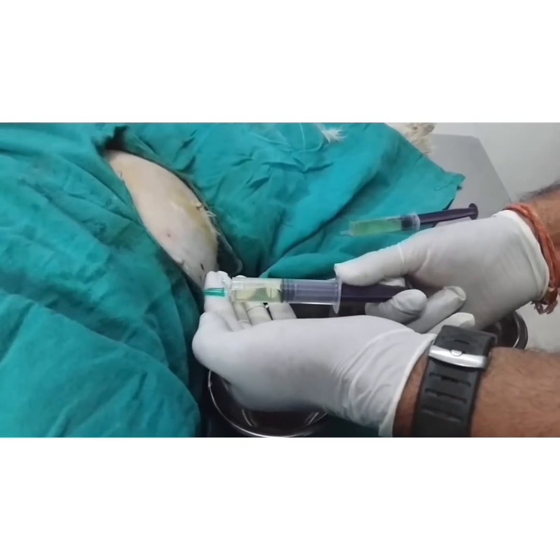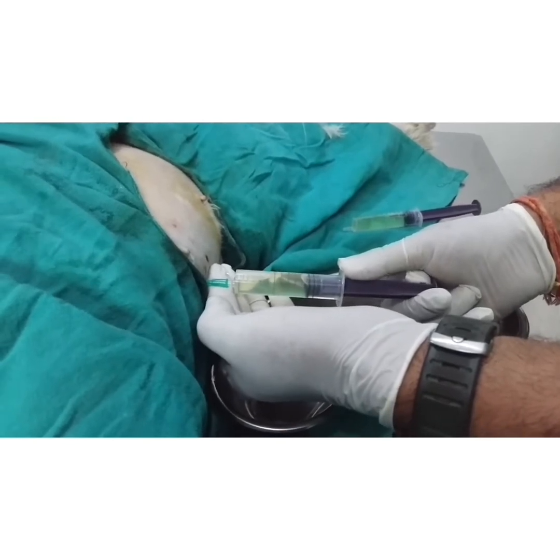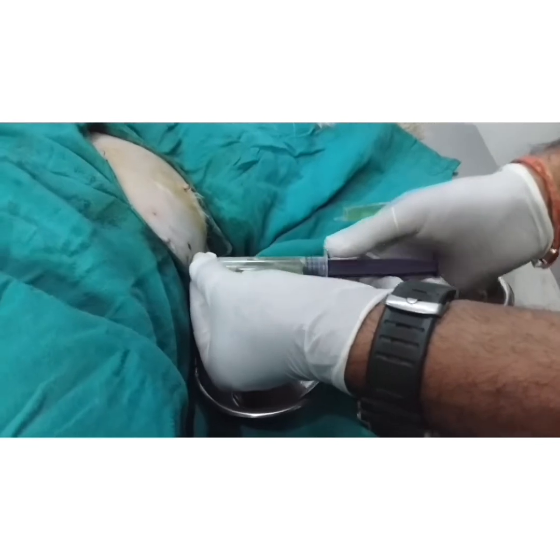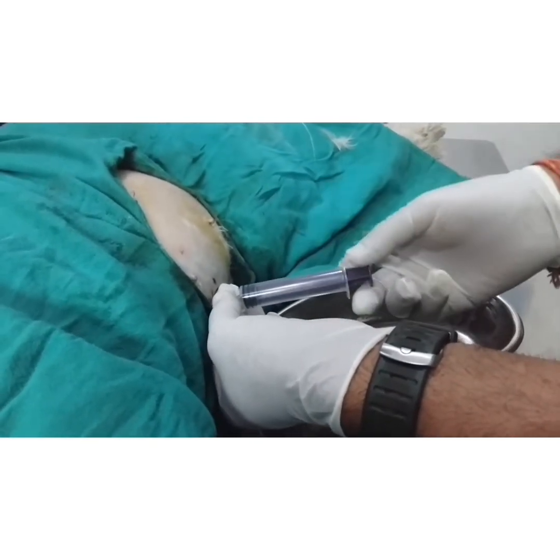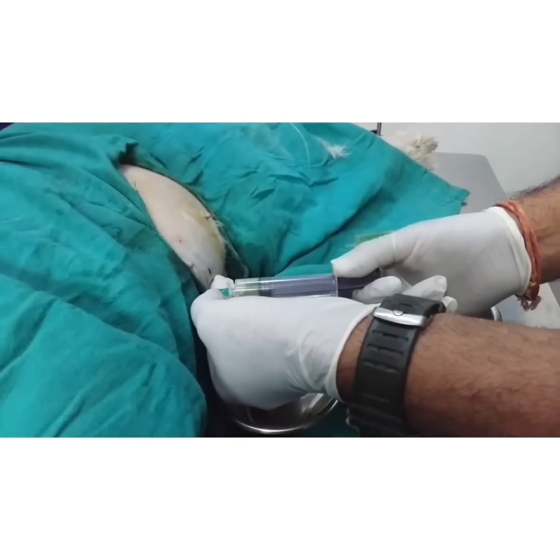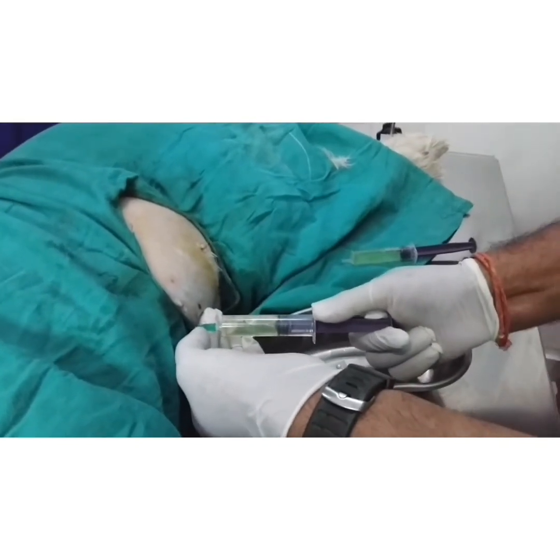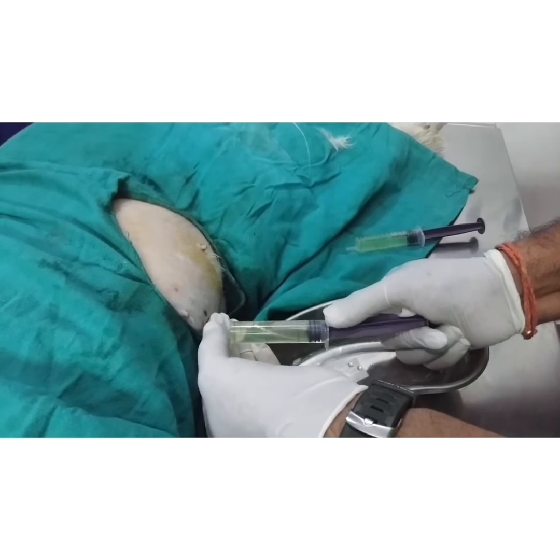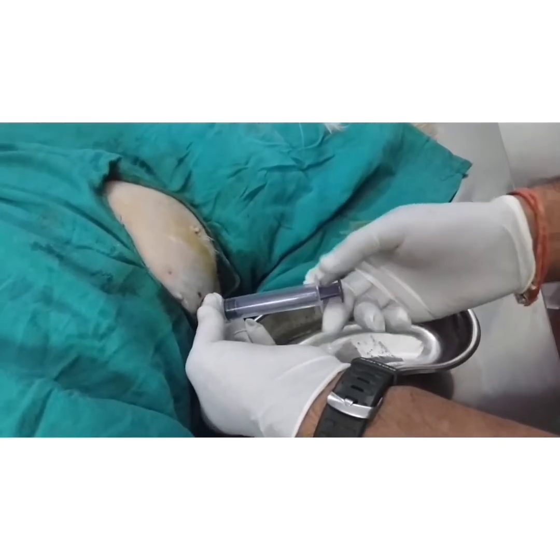Clear transparent ascitic fluid is coming out. If there is any malignancy or TB, chances of blood are there, then the color of fluid will be pinkish or red — there might be blood clots if there is any trauma. I am taking some fluid out to give some relief.